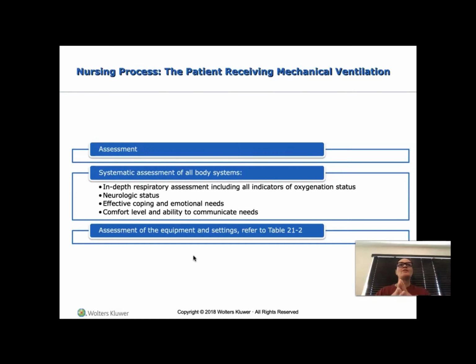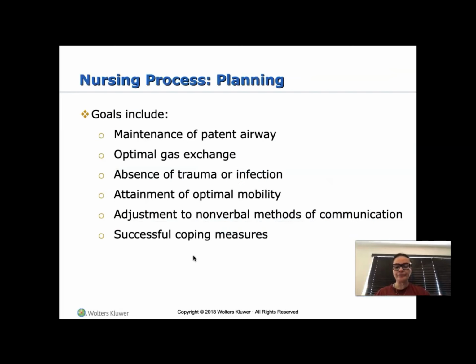Let's do a process of elimination. Did the patient pull the tube out? Is it all the way down where it needs to be? Is their chest rising? Maybe I'm stepping on the cord. Maybe the plug fell out of the wall. Okay, maybe the plug isn't working. Did my machine get turned off? Little things like that, okay? So it's just a trial and error.